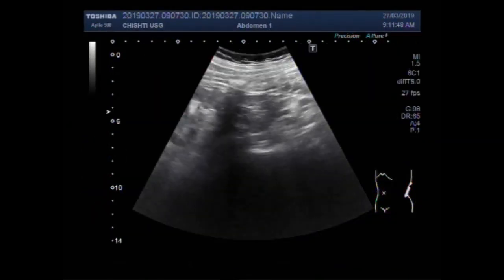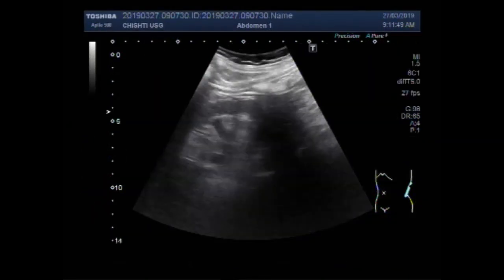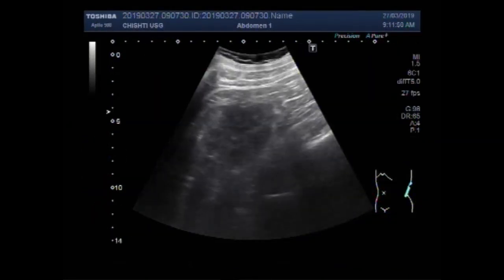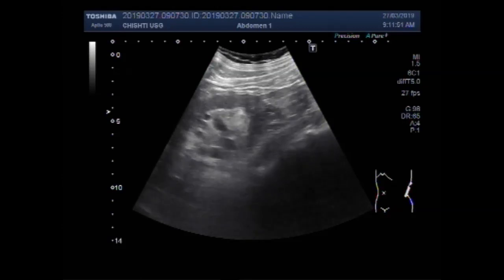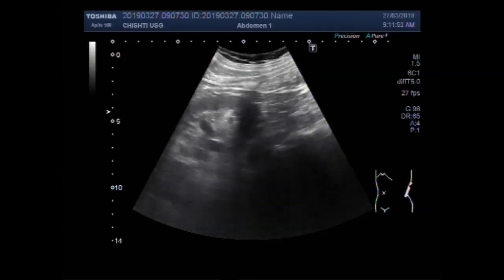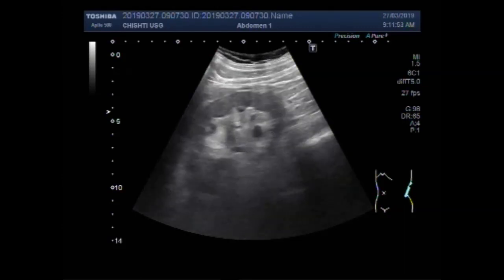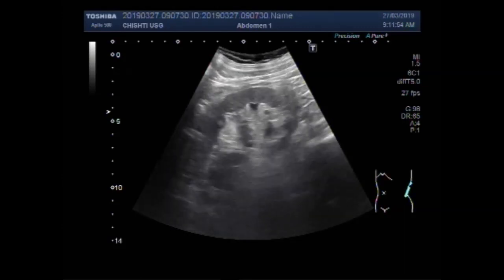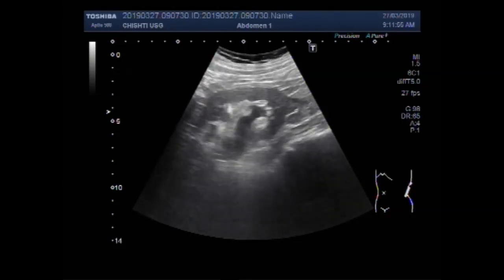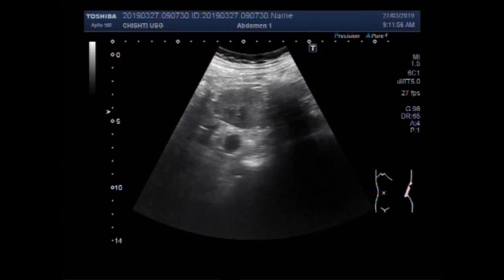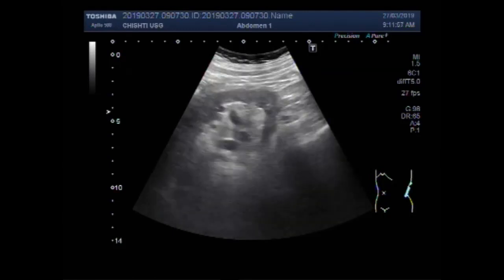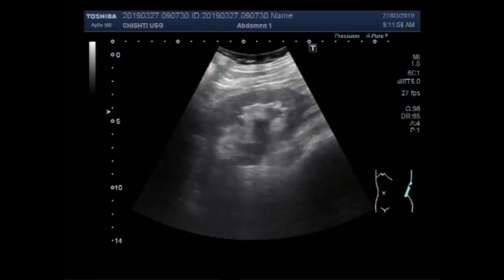Dear viewers, I hope you are all fine. This ultrasound video shows tracing and focusing of the ureteric stone.